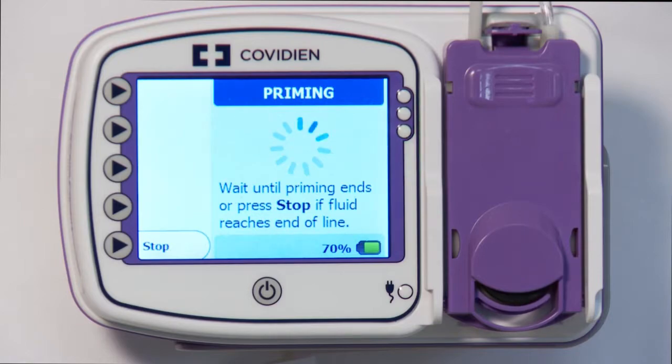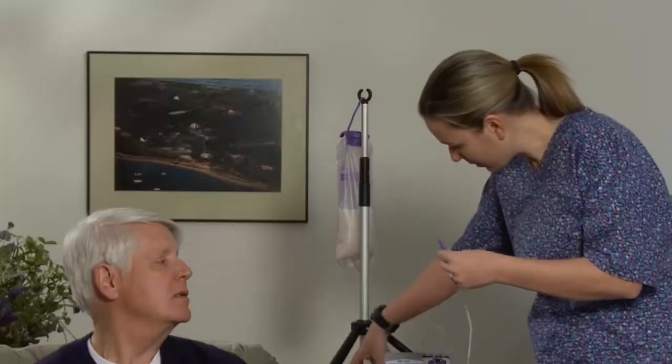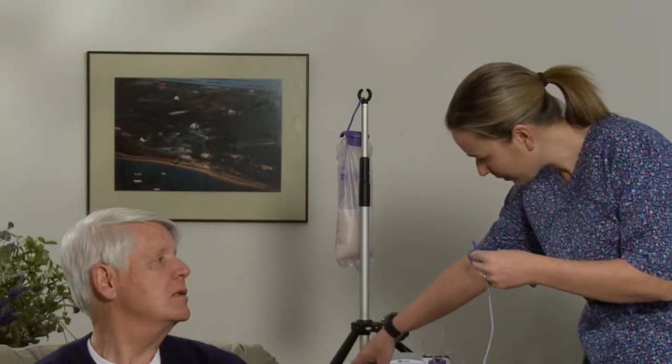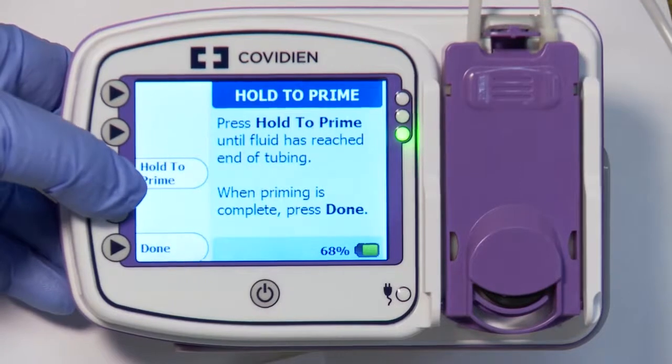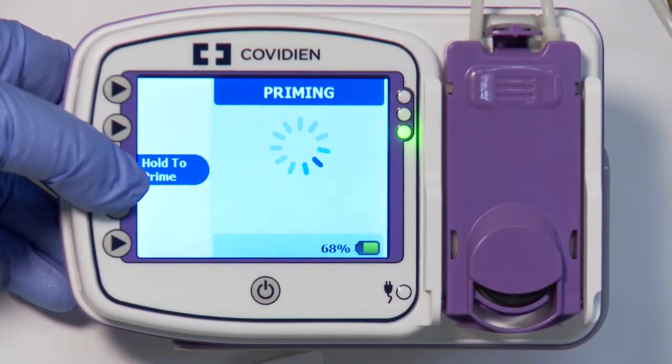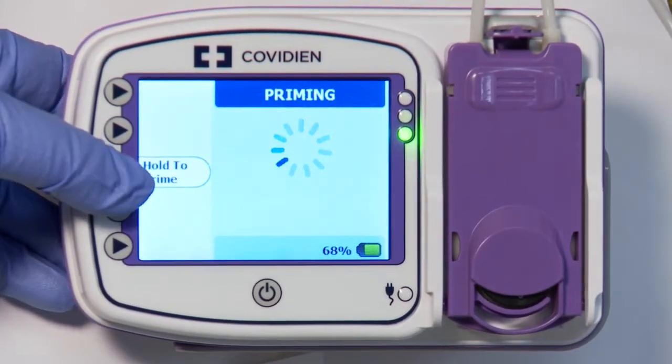Once the auto prime is complete, the feeding solution will stop short of the feeding set connector. To top off the tubing, press and hold the Hold to Prime button until prime is complete. To continue with pump setup, press Done.